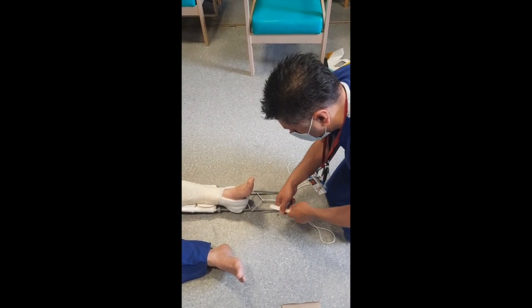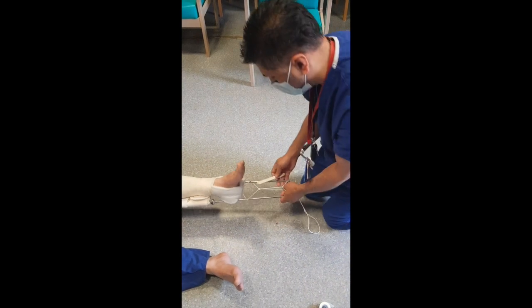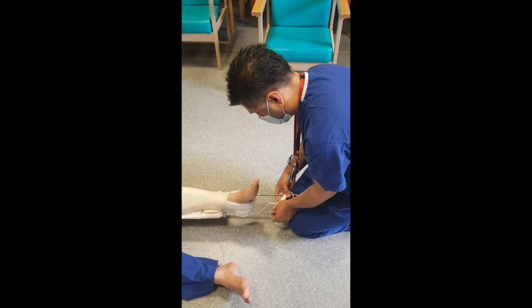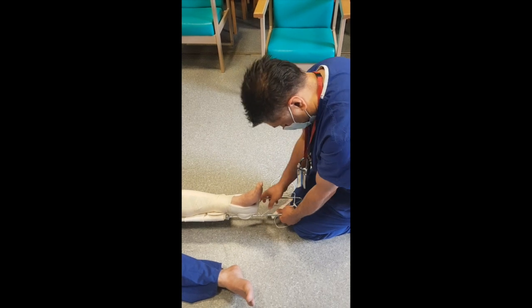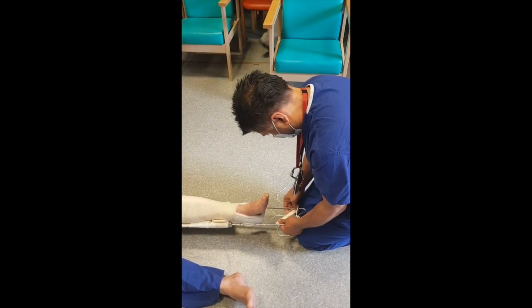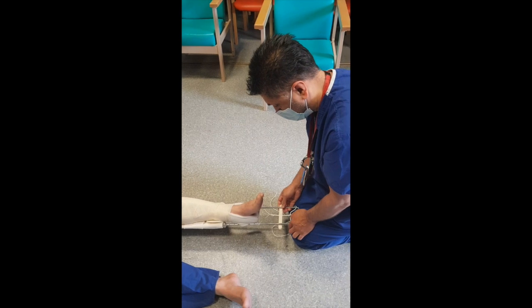I'm using some tape here just to bind them all together. Then the lollipop sticks are going to be applied to the straight part of the cord and then wound round and round, and because they're winding around they're going to generate some tension in the cord, and that's going to pull on the foot — pulling the foot towards the foot end of the splint. It's possible to perceive that there is now traction on that cord and it's pulling the foot more distally. This just needs to be locked off, and this is now traction and it's not going to come undone.